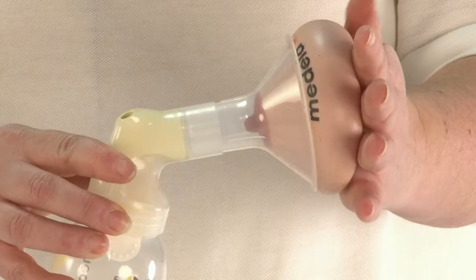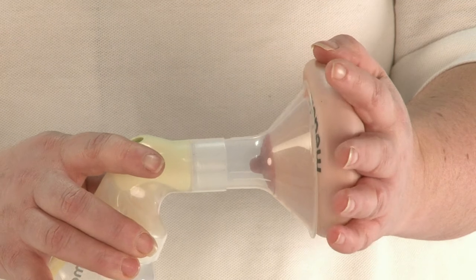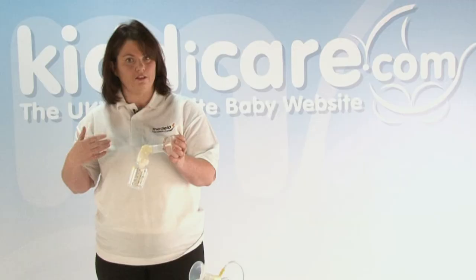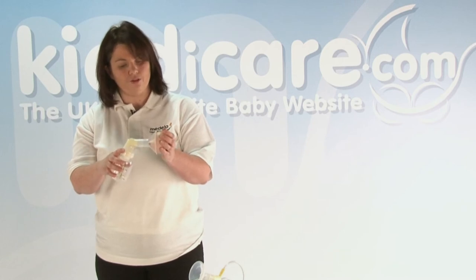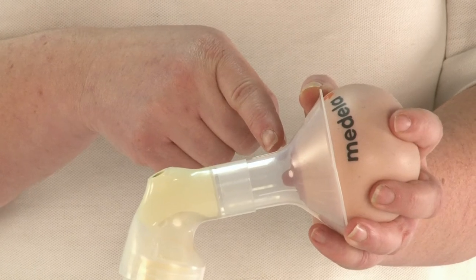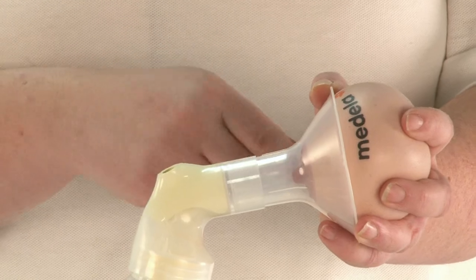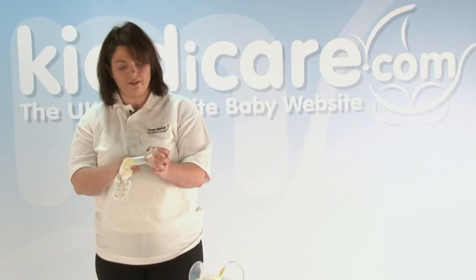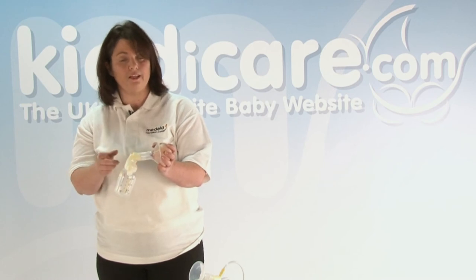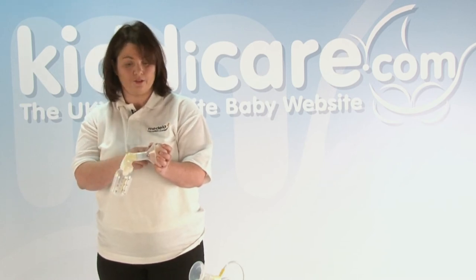Don't press in like that, because that will actually squeeze onto your breast ducts and your milk ducts and may block them off a little bit. So all you're looking for is a gentle seal, making sure you've got no air gaps on the breast. And when the pump is working, you're looking at the nipple moving in and out, in and out.